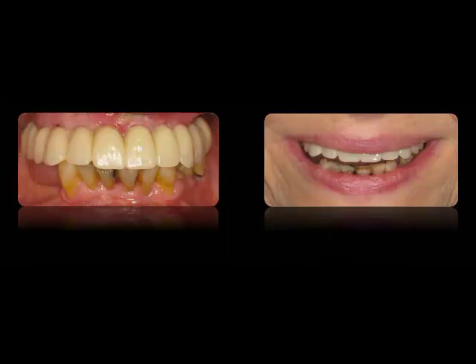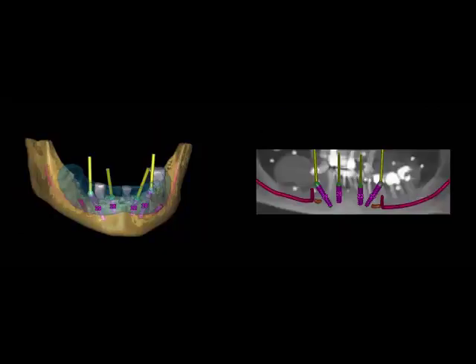And this is what the patient looks like right before surgery. So we did a frenectomy up here, and then we put the bridge in, and then we adjust the occlusion on the lower teeth to fit this new upper prosthesis. At 1 week post-op healing, the tissue responds very well to it, and her smile has also been addressed. But she's not done. She needs a lower jaw now.